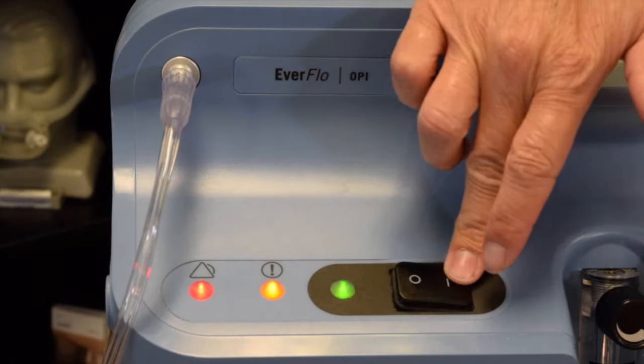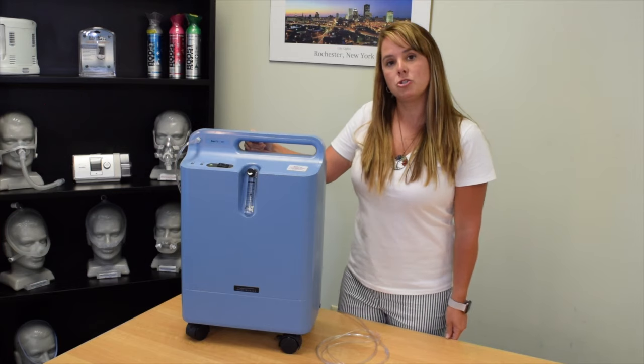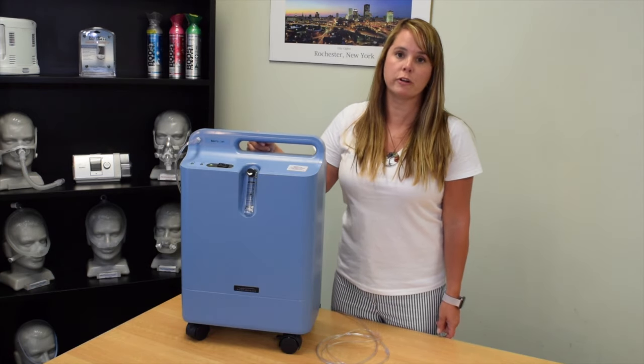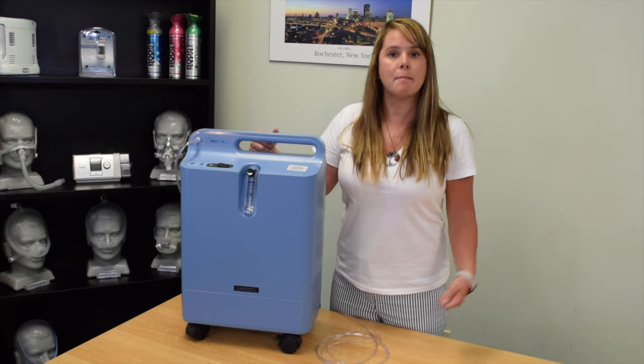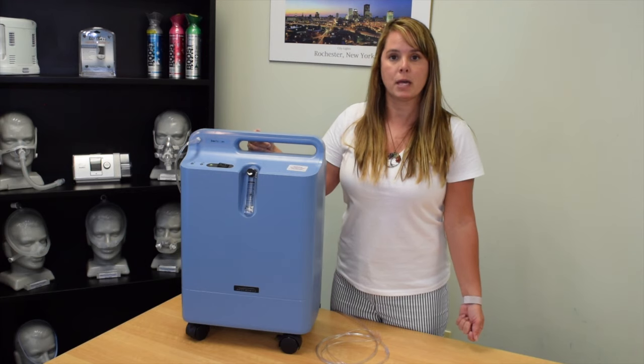I'm going to go ahead and turn our concentrator back on. The second issue you may experience is if your tubing is kinked. You're walking around your home and maneuvering throughout the house with a long tubing connected to your cannula, and that may get stuck under a chair or around a corner and it may have a kink in it.